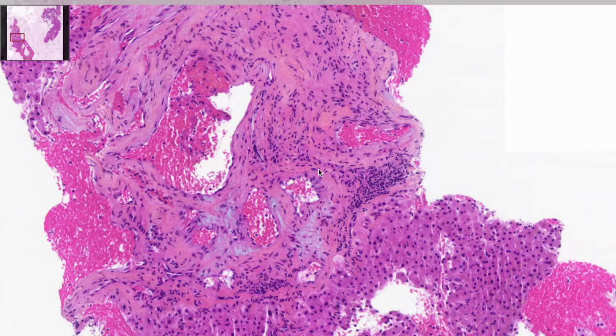It's good news for the patient, and it's a classical trap for radiologists, because when the angioma is atypical and fibrotic or has undergone thrombosis, its appearance may change and it may look like metastasis. So in this case, the biopsy is likely a hemangioma, so good news and no malignant proliferation. So it's a classical trap.